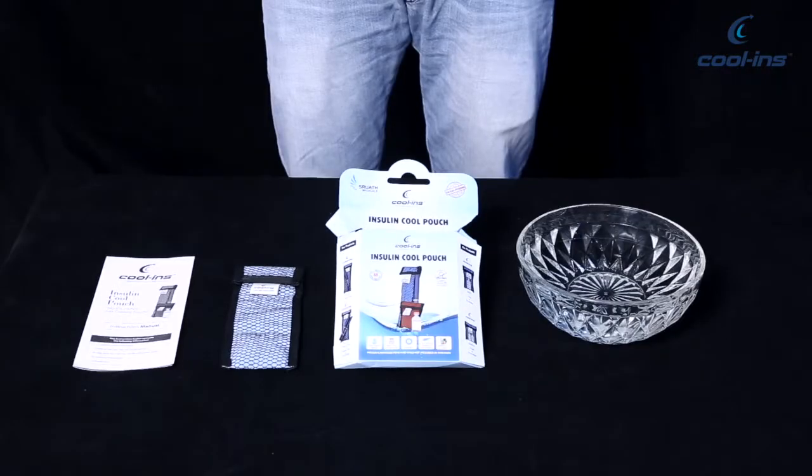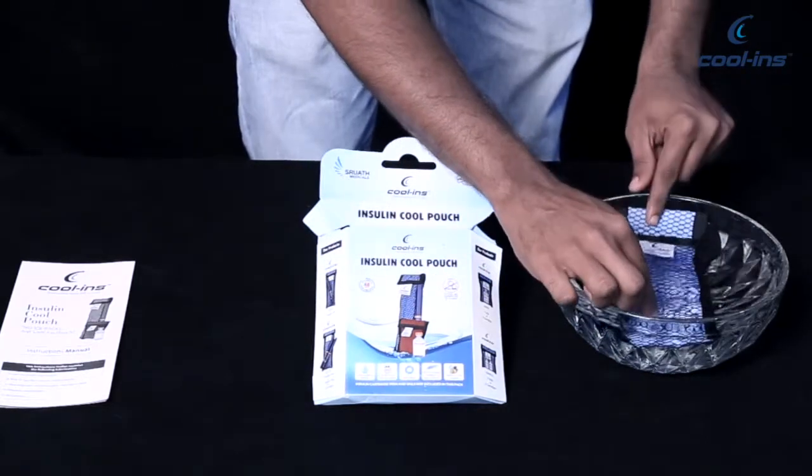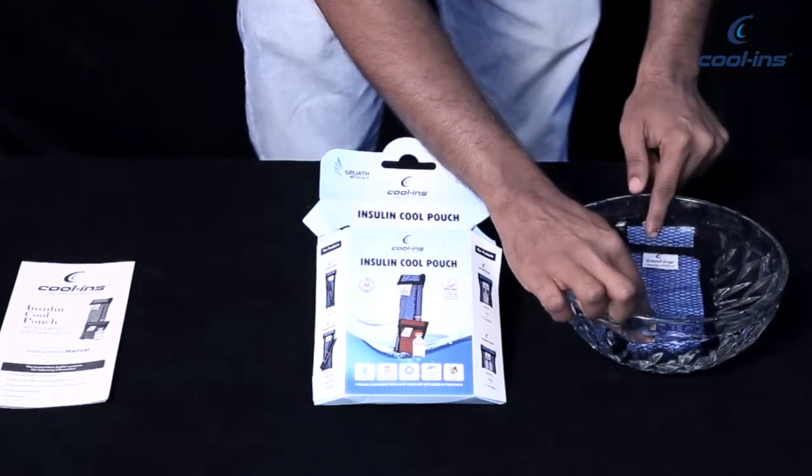To activate the Insulin Cool Pouch, you would need normal room temperature water. Simply immerse the Insulin Cool Pouch into the water as per the prescribed time given in the user manual.